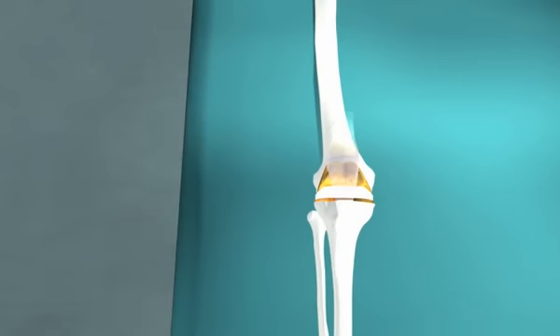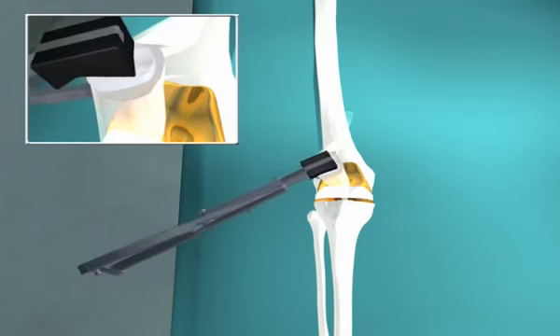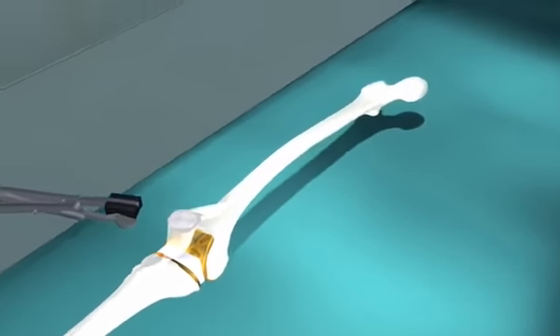The patella is then cemented into place into the 3 lug holes previously prepared, and the patella clamp can be used to squeeze it in position and hold the patella while excess cement is removed.